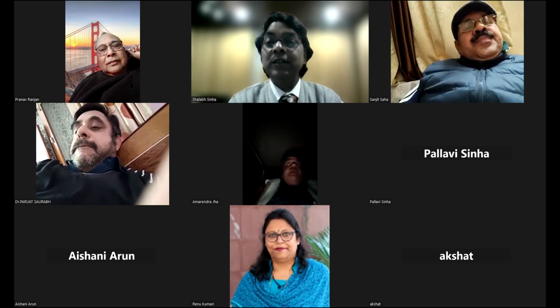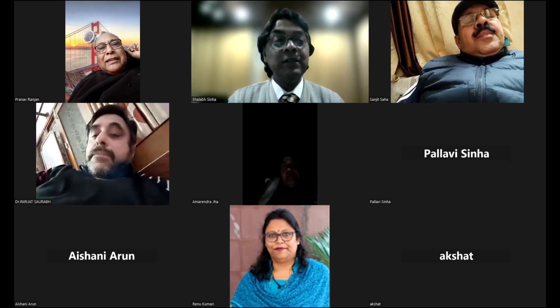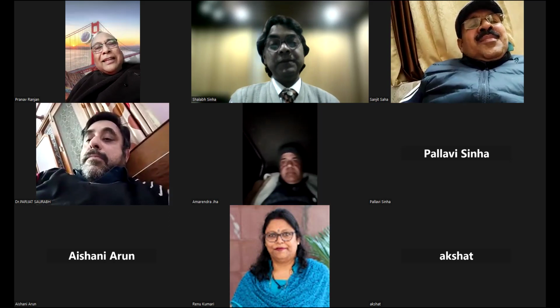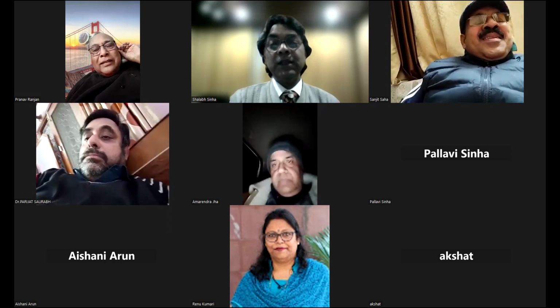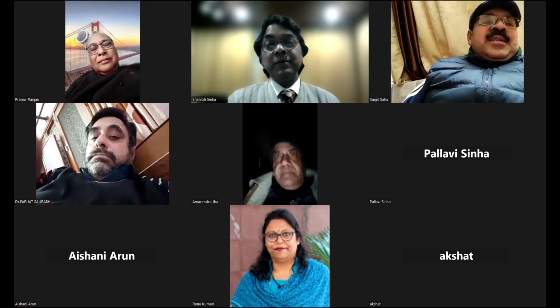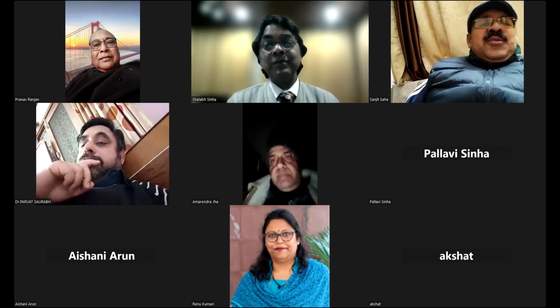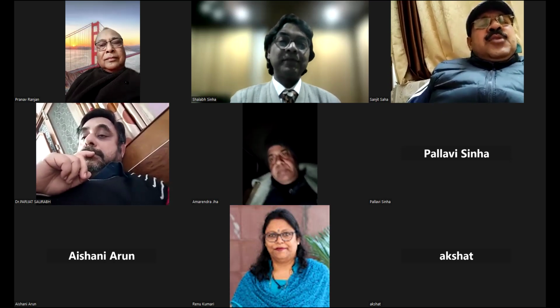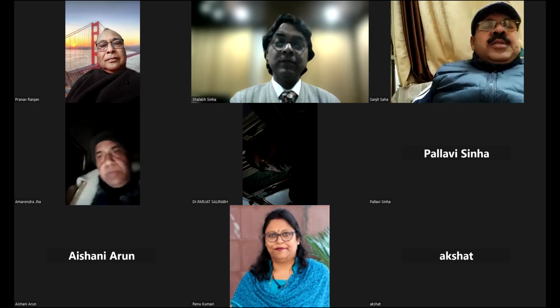Right, right. So thank you, sir. So hydrodissection is really important. Although it is innocuous, people think that there is no technique involved, but it is a really important step. When we are doing ECC, it is hydrodissection, but when you're doing phaco, it is CCH, cortical cleaving hydrodissection. That's the difference, nothing more. In ECC, we are doing hydrodissection only, and here we're doing CCH, cortical cleaving hydrodissection.